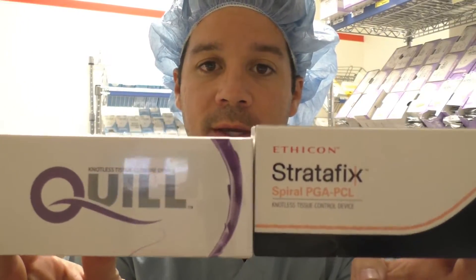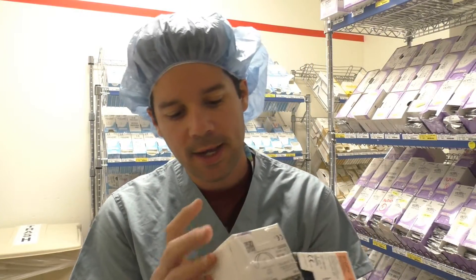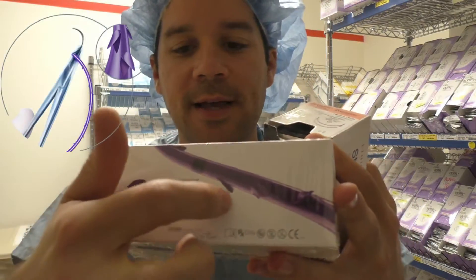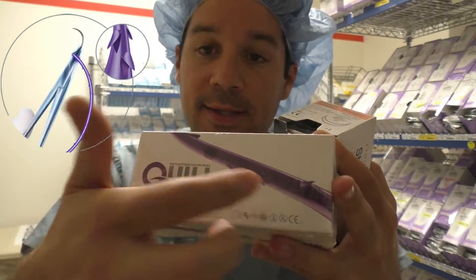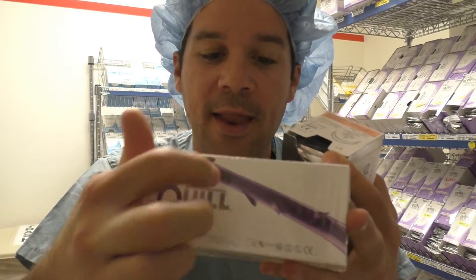The first crazy type of suture I want to share with you guys are these guys right here — the Quill and the Stratafix. These are interesting sutures, and you can kind of see from the picture here on the side of the box that the suture itself has these cutouts. It's a monofilament suture, but it has these little cuts, these little barbs, and all of those barbs go in one way. What's interesting about this is that it enables the surgeon to not have to tie a knot.